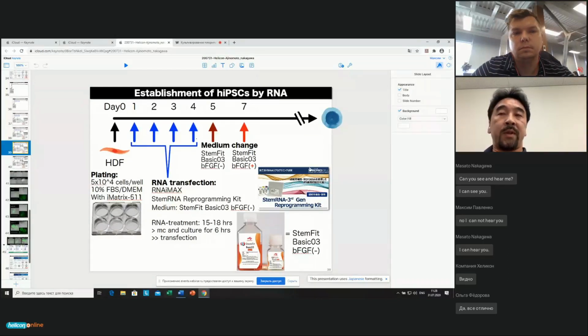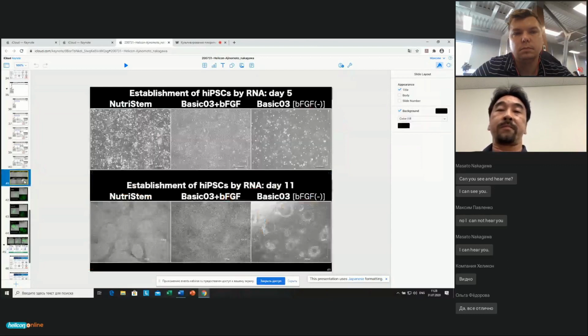Next slide, please. From day 10 to 14, I check the establishment of iPS cells by morphology or flow cytometry to check the expression of TRA-1-60, which is a marker for human pluripotent stem cells. Next slide, please.